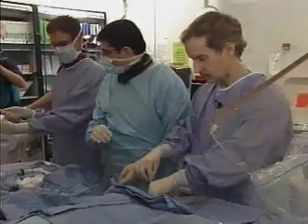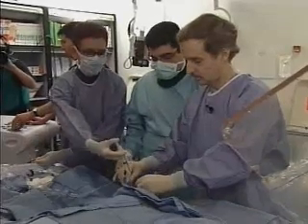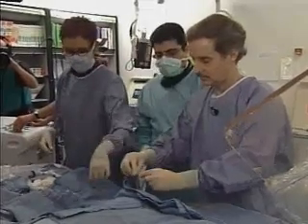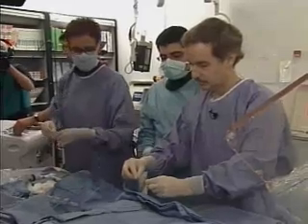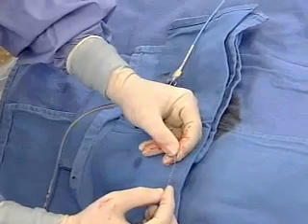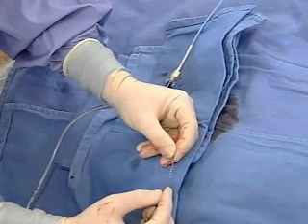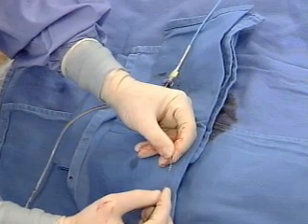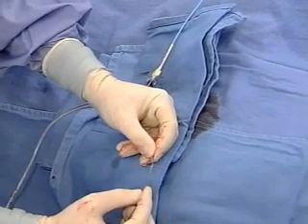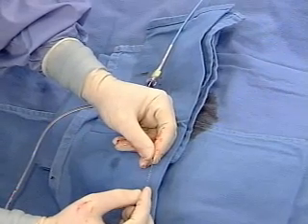Let me answer a couple of questions. We had a couple of questions come in by email, which I'll answer while you're getting the stent prepared for entering into the body. Someone asked, what factors determine whether a patient receives a stent or has open heart surgery? That's a very good question. The answer is that now that we have the drug-eluting stents, many patients who historically would have been referred for bypass surgery can now be treated with results comparable to or perhaps even better than bypass, even if they have 2 or 3 blockages.